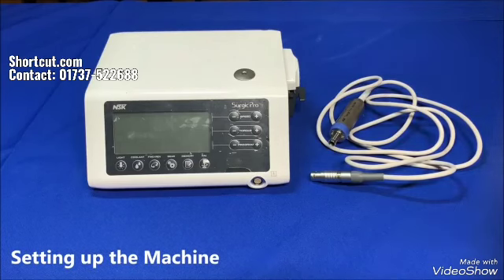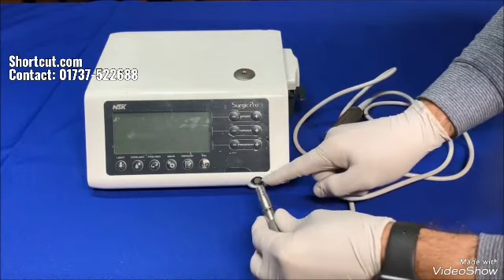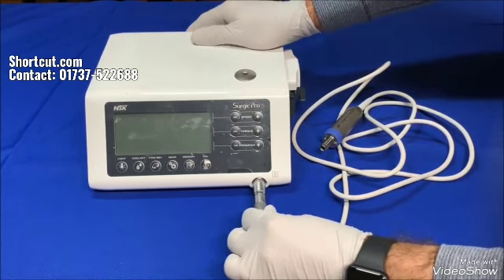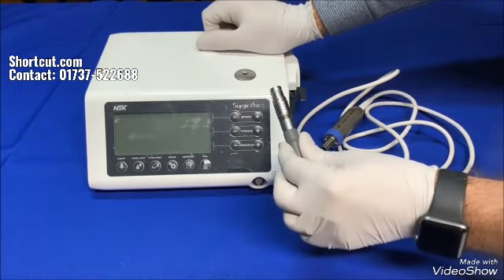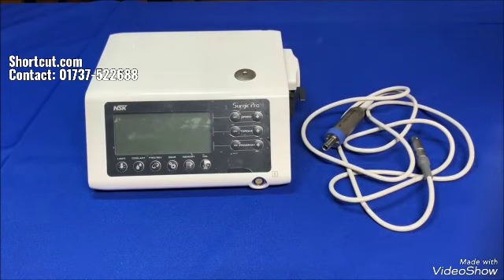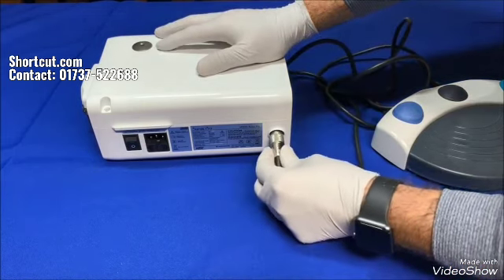Let's set up the machine. We begin with connecting the motor cord by aligning the marks on the cord connector and the jack on the control unit. Push it until it clicks and pull it a bit to make sure it's locked in. To disconnect, you'll need to pull back the metal sleeve with one hand a little bit and pull the cord out with the other hand. Connect the foot control cord pretty much in the same way, except there's a secure lock nut to screw in.